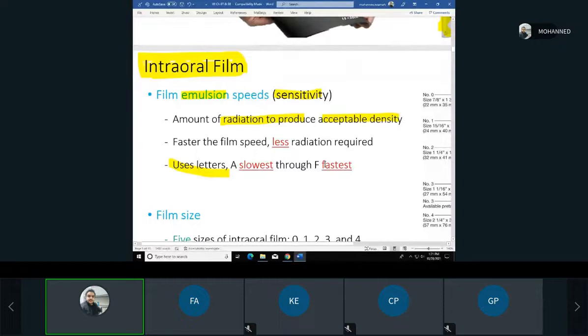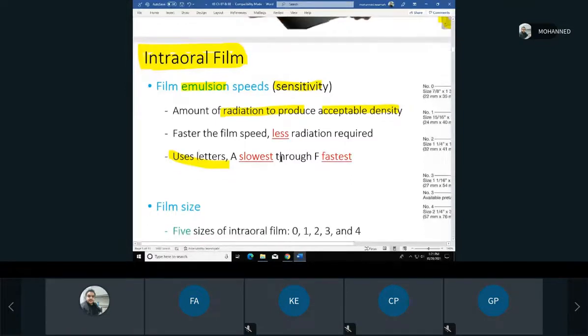And again, most probably, if we continued with manual films, we'd get more letters and faster speeds and less exposure. But now with the digital, we have all of that. All good?